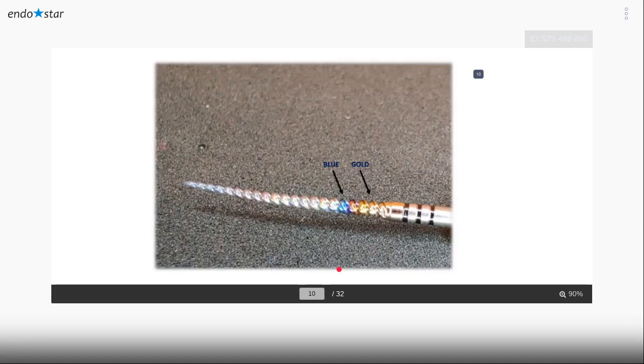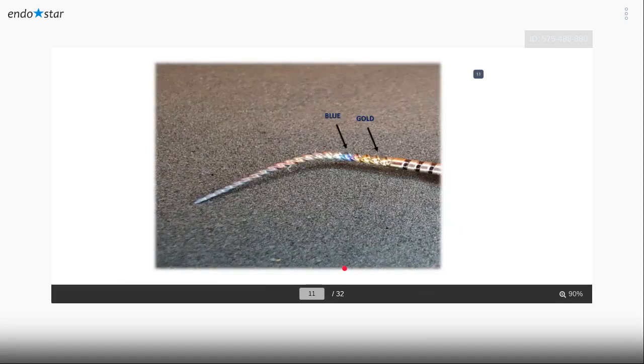As you want to see in the next slide, I curved the file, and you can curve it here and keep the shape, gain the super elasticity, and at the same time shape memory. So if you sterilize it back again, it will return back.